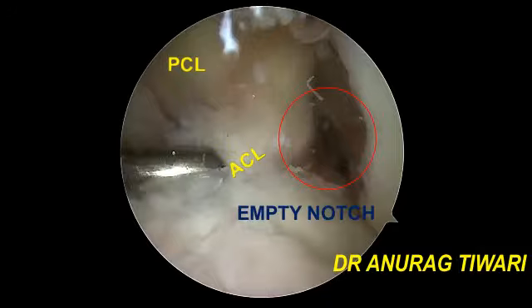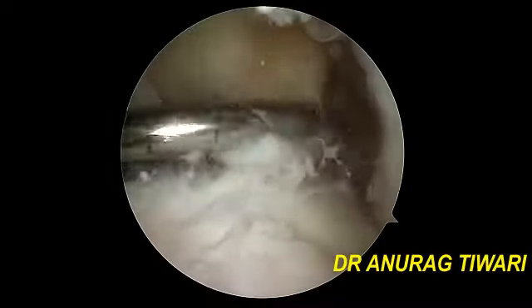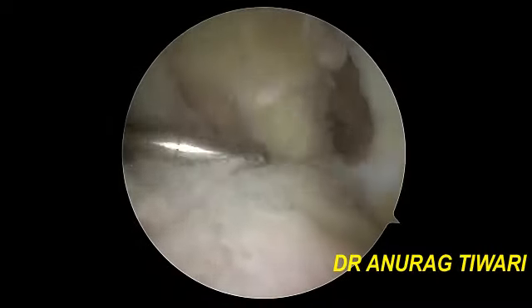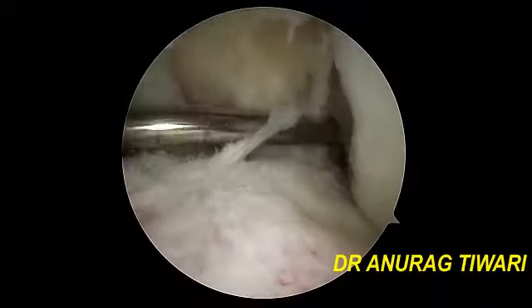This red marked is the empty notch sign. Here is the insertion of the ACL, which has been detached and is lying flat. So we will be just debriding the ACL. These all fibers are of the ACL. So once we have debrided, you can see the clear picture.